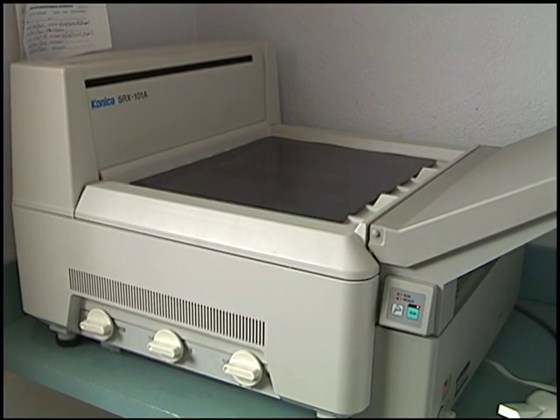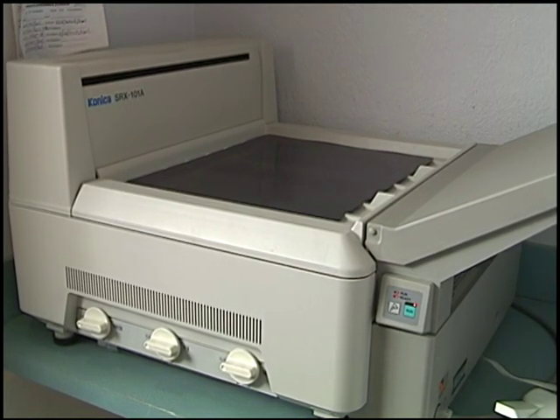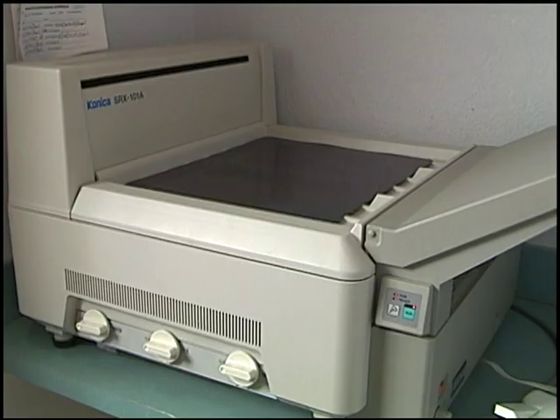Automatic processors are a faster, easier method of developing X-ray films in practices that develop enough films to justify their additional expense. These automated machines develop the film with the use of developers, fixers, and rinses just as in manual processing, but the process is automated and sped up by using special developers and fixers at higher temperatures. Automatic processors will require a bit more maintenance, but they produce a fully developed, dry X-ray film in 1 to 4 minutes. There are many different processors on the market, but most require simply inserting the film at one end.